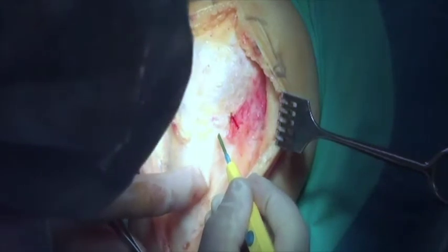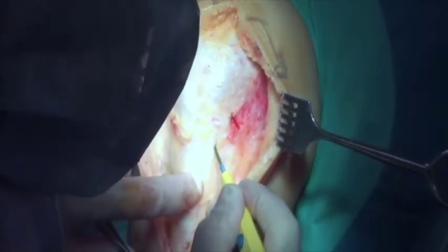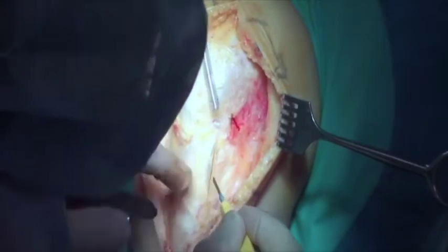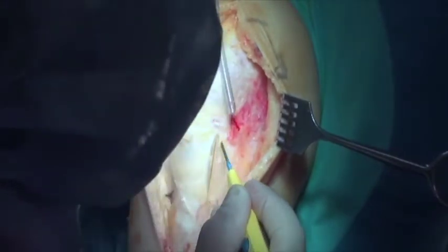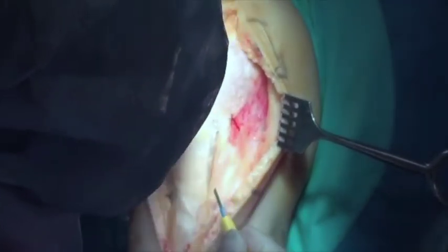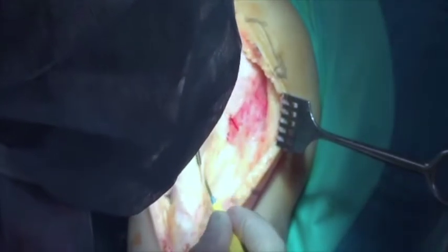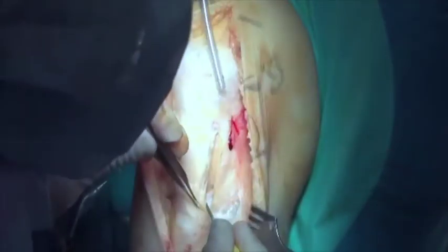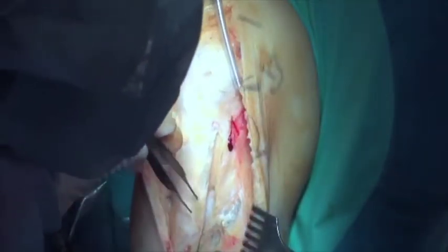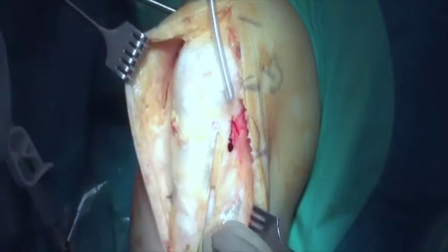After a midline longitudinal skin incision is made, dissection is carried sharply down to the patellar tendon, tibial tubercle, and patella. Skin flaps are developed and meticulous hemostasis is obtained. The patellar tendon and tibial tubercle are sharply isolated, and the lateral side of the patellar tendon is freed.